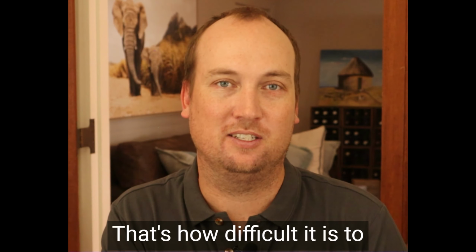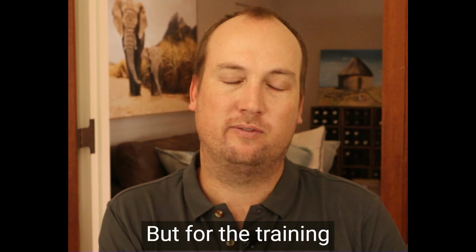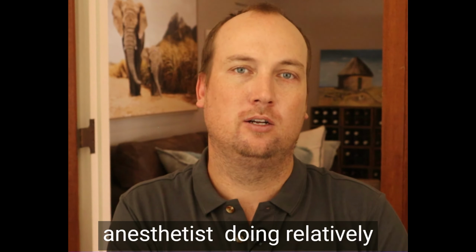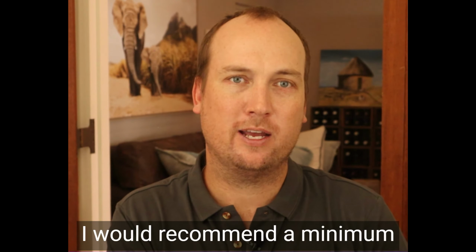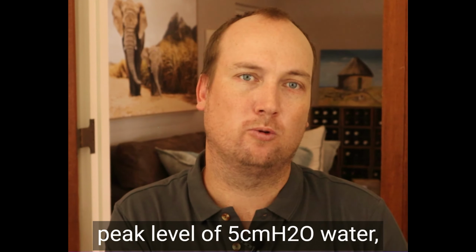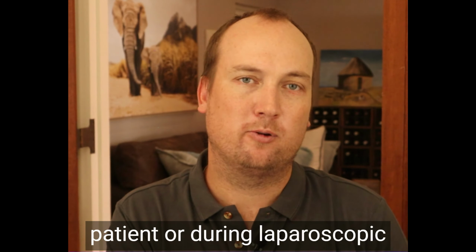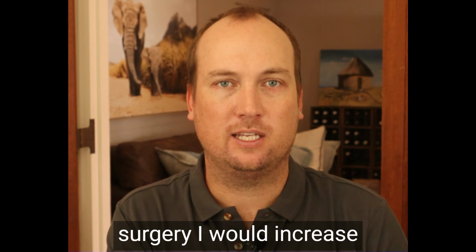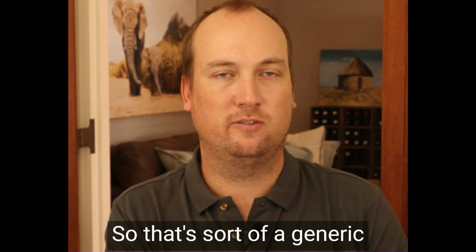That's how difficult it is to ascertain the optimal PEEP level. But for the training anaesthetists doing relatively safe standard anesthesias, I would recommend a minimum PEEP level of 5 centimeters of water, and in the pregnant or obese patient or during laparoscopic surgery, I would increase that PEEP level to 10 centimeters of water. Okay, so that's sort of a generic approach to PEEP.